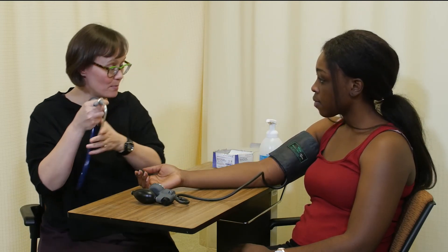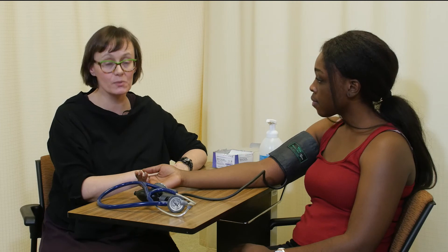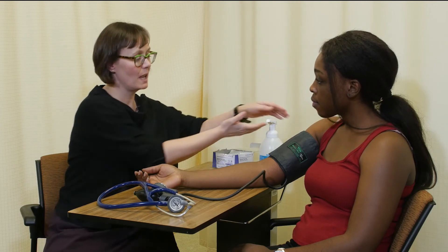Your blood pressure was 112 over 62, which is within the normal range. I would also normally take a pulse whenever I take a blood pressure. That's a demonstration of the two-step blood pressure measurement technique — now you can try it out yourself.